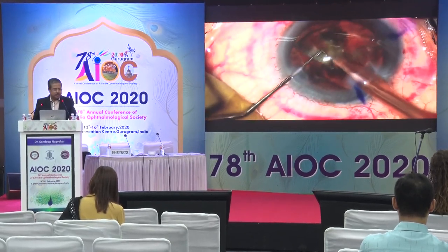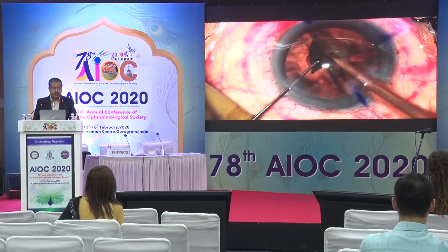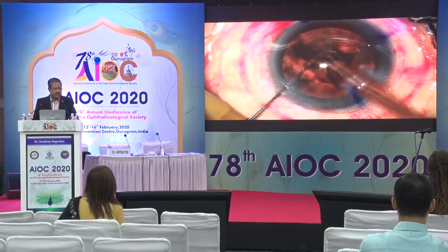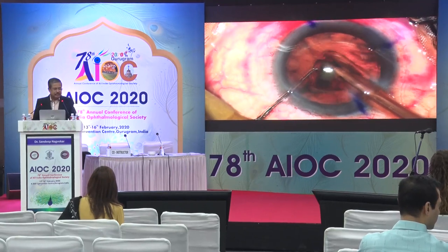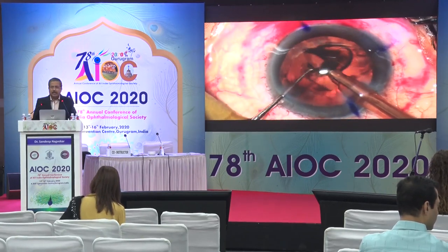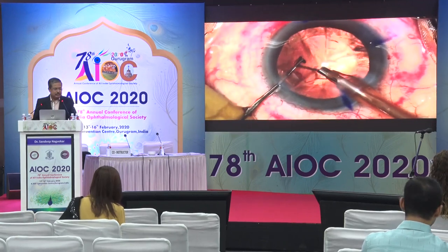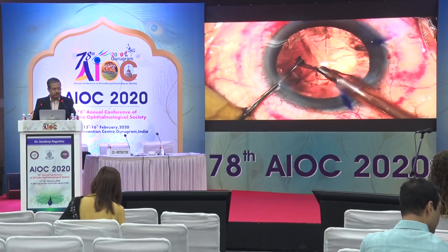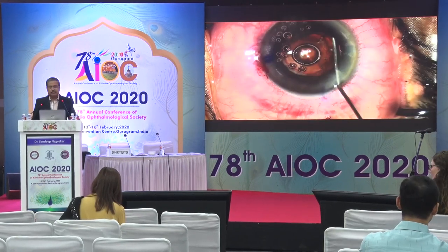Using a combination of torsional and longitudinal ultrasound ensures the fragment remains at the tip, making it easy to aspirate the nucleus. Always keep the chamber stable because of the risk of potential damage to the corneal endothelium. Do not use very high vacuum when aspirating pieces — typical vacuum setting would be about 350 mmHg, with a flow rate of about 30 and a bottle height of 80 to 100.